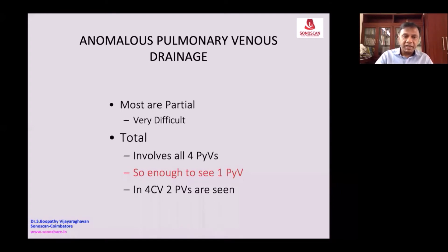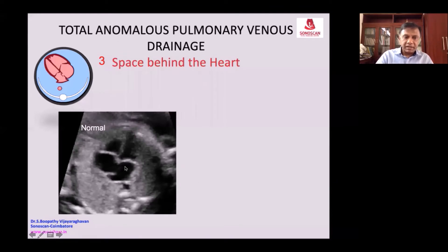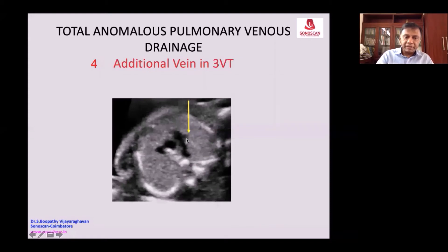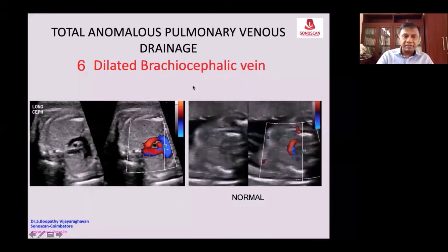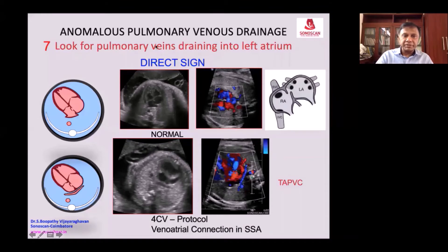At present, we aim to diagnose only total anomalous pulmonary venous drainage. Here you see the left atrium, which is very close to the descending aorta, which is in front of the spine. You see an additional vein — it can be left SVC or brachiocephalic. The brachiocephalic vein is seen as you make an axial sweep of the heart. You look for the pulmonary veins draining into the left atrium.